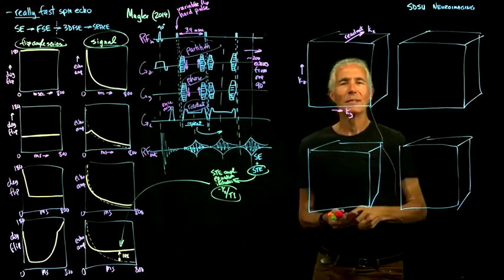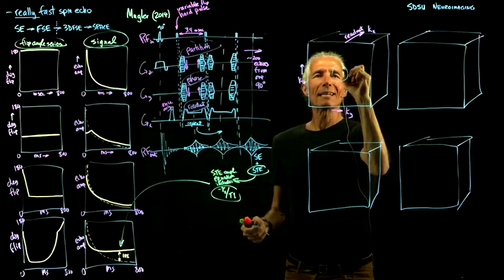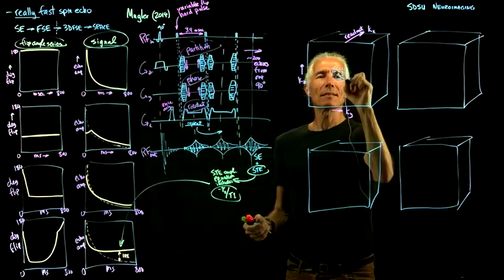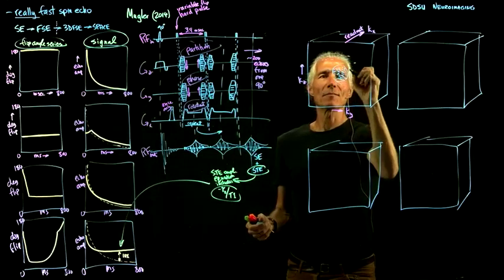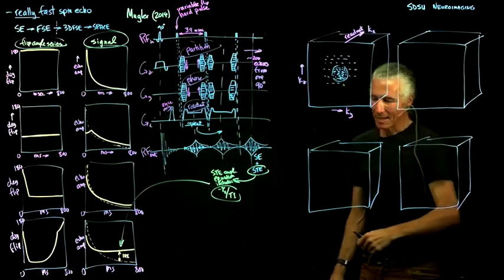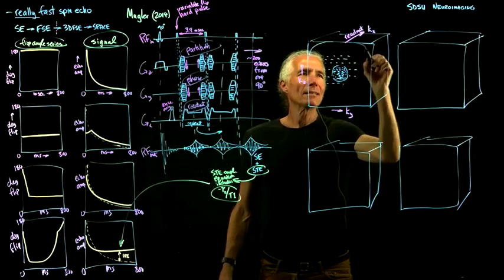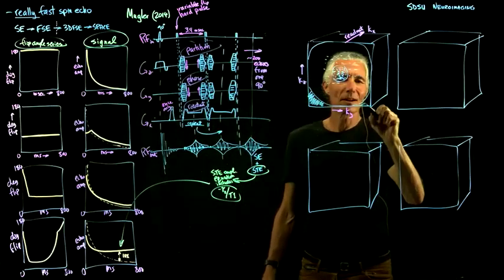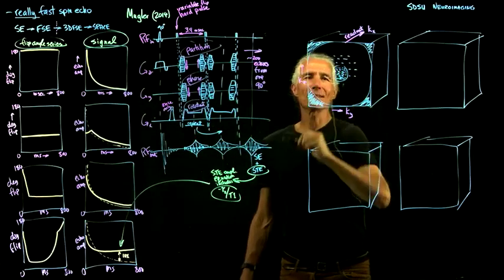So what's the first way to save points? Basically, just record a lot of data in the center of K-space, and then when you get out to the outside of K-space, record less data, because we know that the center of K-space is particularly important for controlling the contrast. So just start leaving out some data points. Don't bother recording all the way out to the edge like that. So just record like a cylinder of data. So throw this away. That's kind of extra high frequency. Don't mess with that. So throw all that away. That saves a little time.